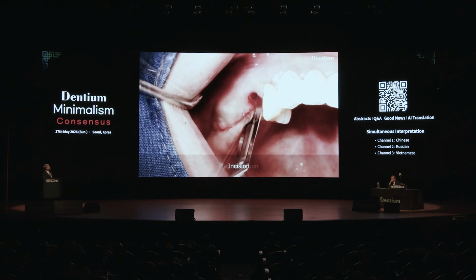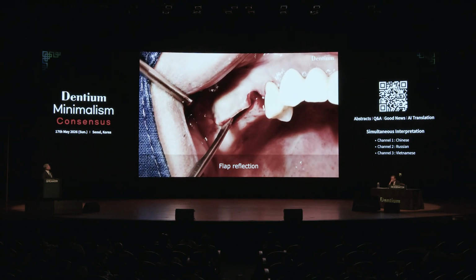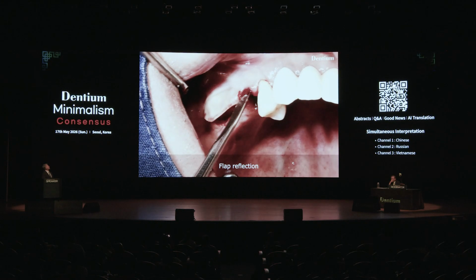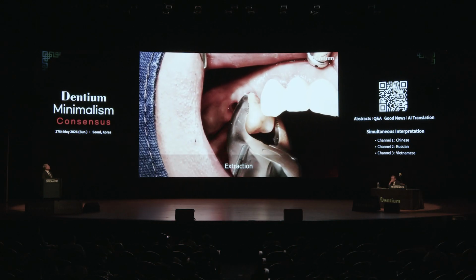So clear-cut the periosteum. Yes, and this video is about some of our clinics and some lateral approach concepts.